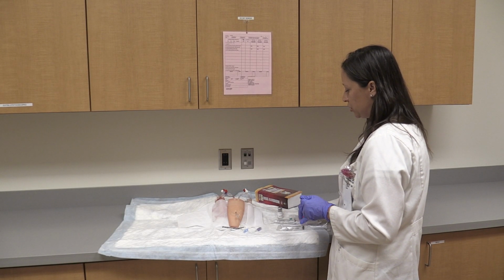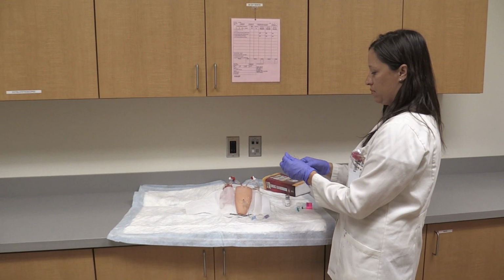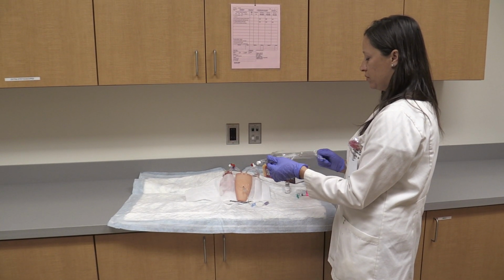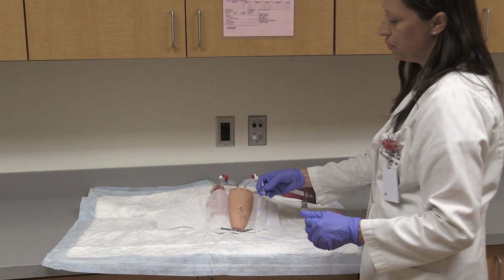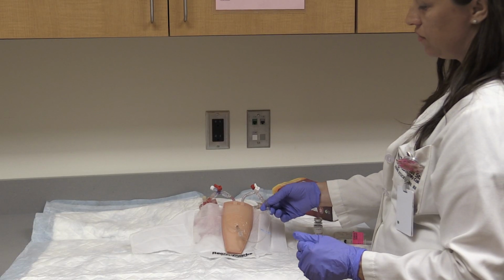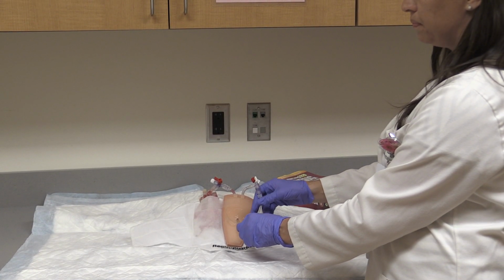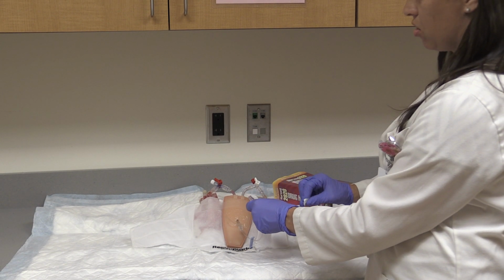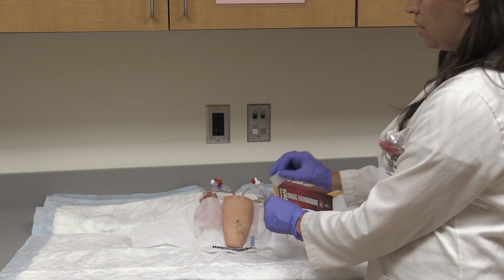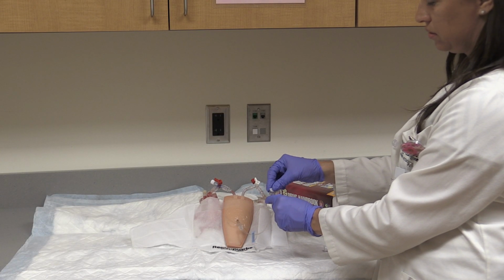So the first thing I'm going to do is open up my saline flush, and I'm going to pick up the IV, and you can see that it's clamped. So I need to unclamp that. And I'm going to take an alcohol swab, and I'm going to cleanse the site for 15 to 30 seconds.